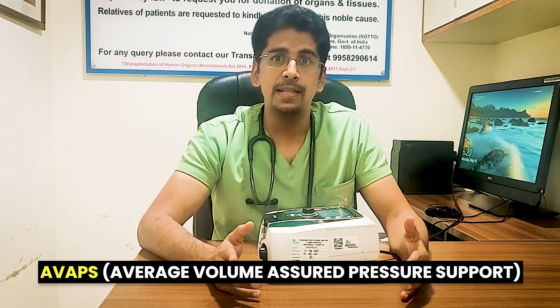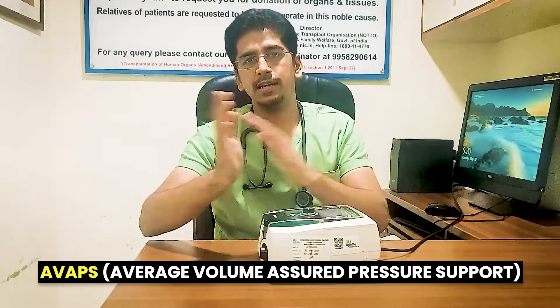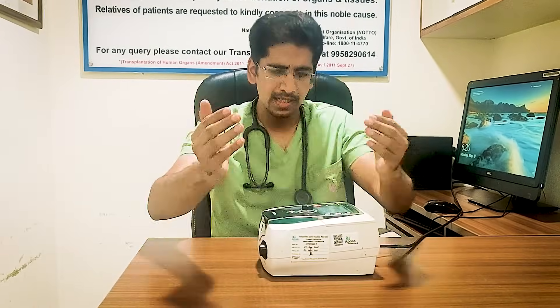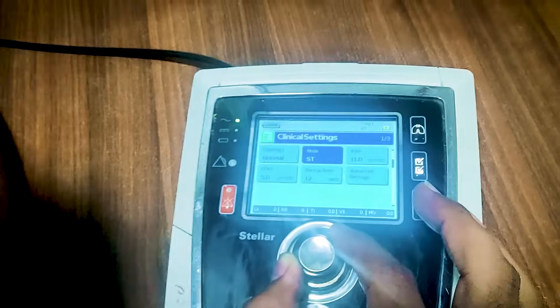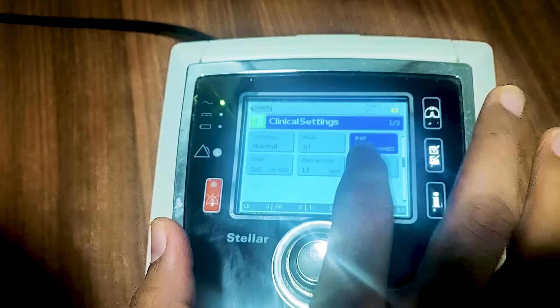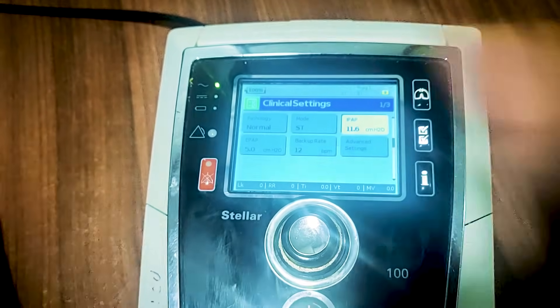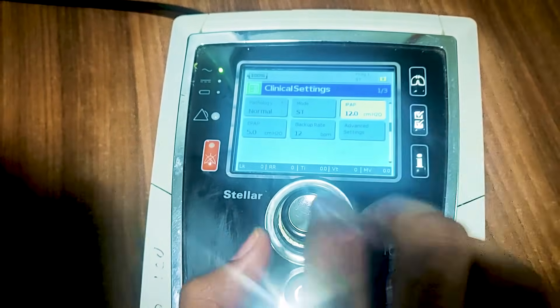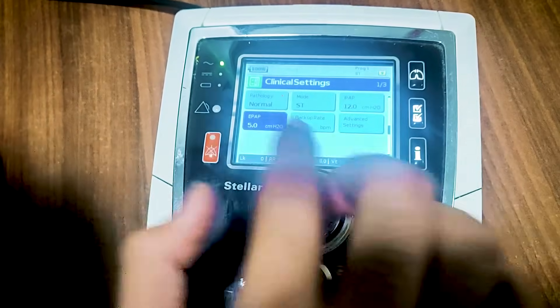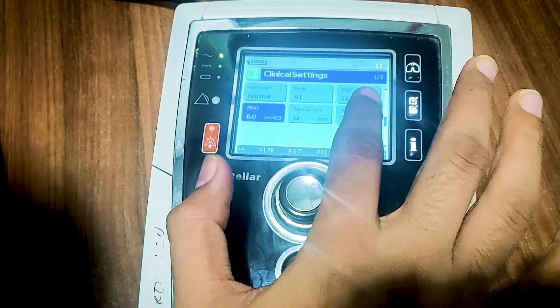There is another mode commonly used called AVAPS — Average Volume Assured Pressure Support — which I will discuss in another video. Now let's look at the screen. In ST mode, if you want to change the IPAP setting, press it and you can increase or decrease it. For example, setting it at 12 centimeters of water — press and adjust. The current setting is 12 by 6, with a backup rate set at 12.